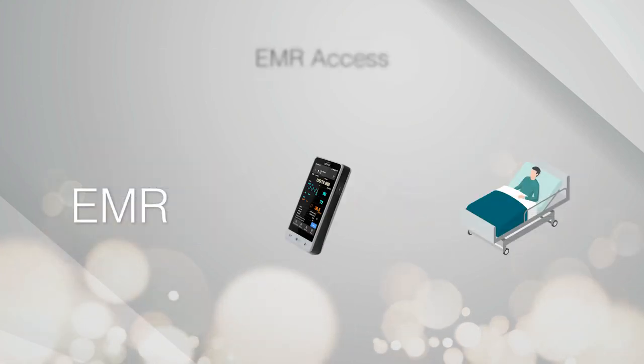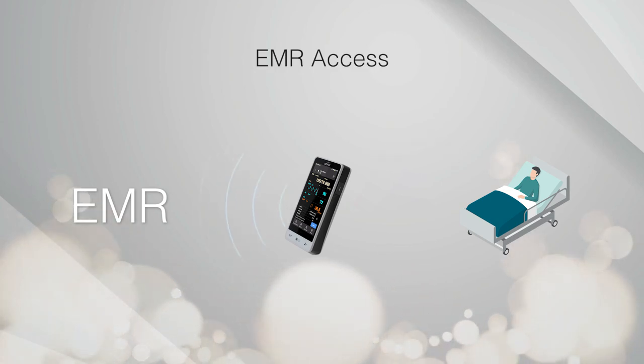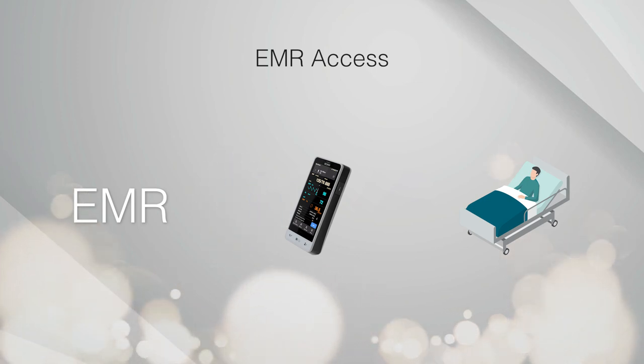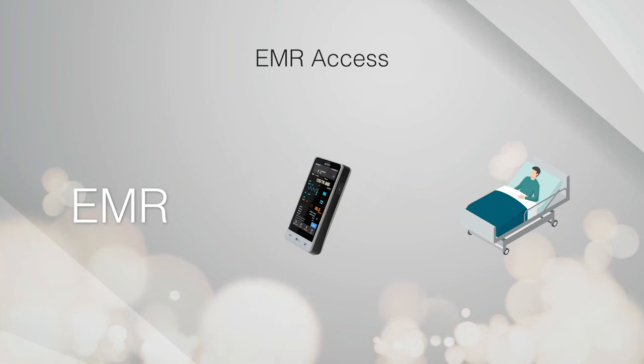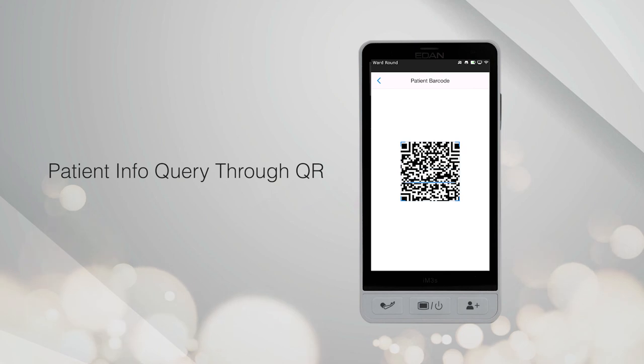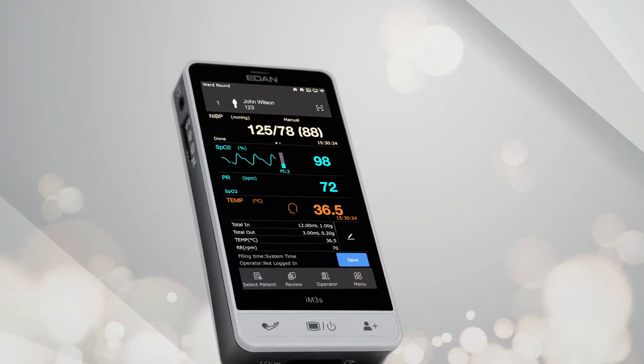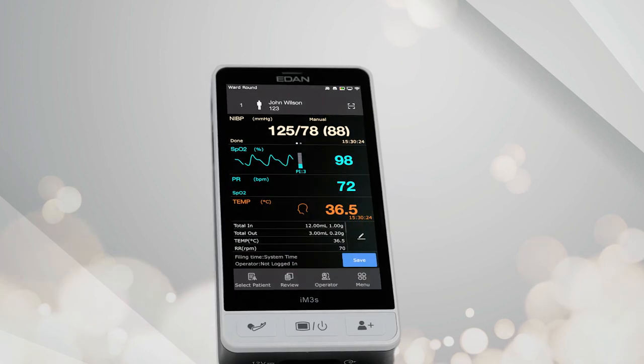Wireless EMR access may be required in some cases. The IM3S employs a built-in Wi-Fi module that supports both 2.4 GHz and 5 GHz networks. The optional built-in barcode scanner can be used to acquire patient info from the EMR, while the data can be sent back with the measurement. The IM3S Vital Signs Monitor — spot checks in your hand.